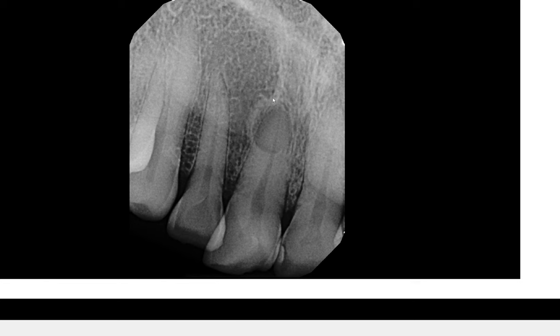If you look carefully, this corticated border also appears to be continuous with another border that extends superiorly. The left side of the border is not well visualized. This perceived border is actually the lamina dura of number eight. So this was two years ago.